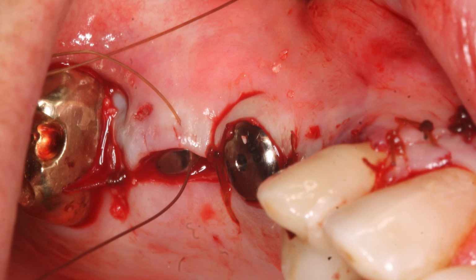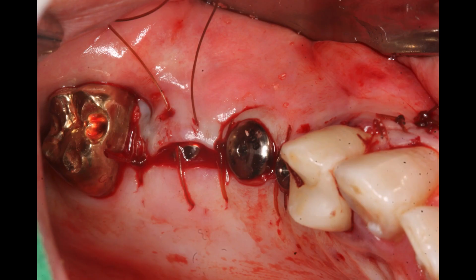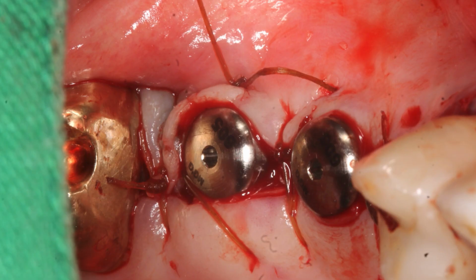But at this point, I just want you to understand the sutures need to take small bite from the edge, no more than, in this case, you can see maybe 1.5 millimeters, but no more from the edge of the flap. And then the other characteristic is that the position of the suture bite has to be narrower or inside the diameter of the healing abutment. If not, we get in trouble. So it's very hard to see this in a three-dimensional way, but basically I will have some graphics to describe this in just a minute.